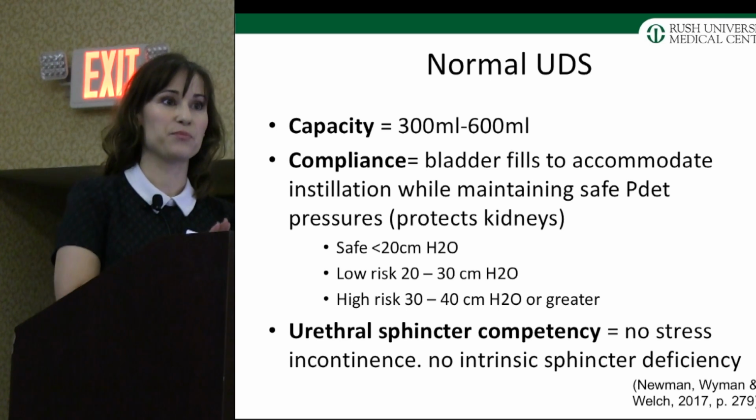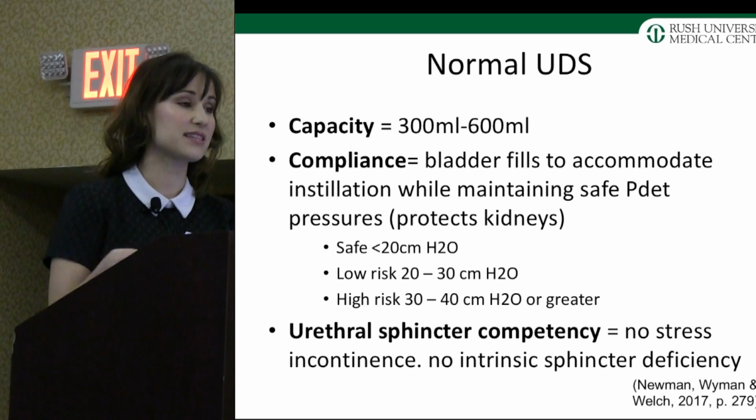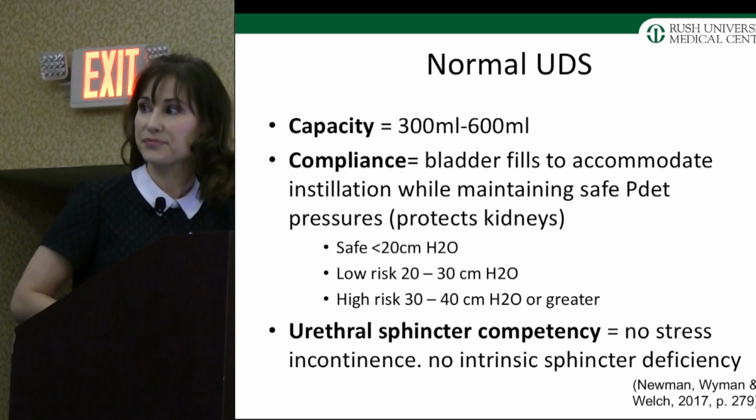So anything above 40, we call a hostile bladder. If you have a patient and the pressure keeps going up and up and stays above 40, you should drain their bladder and stop the test for their safety.